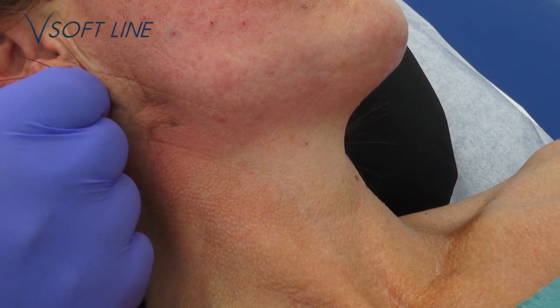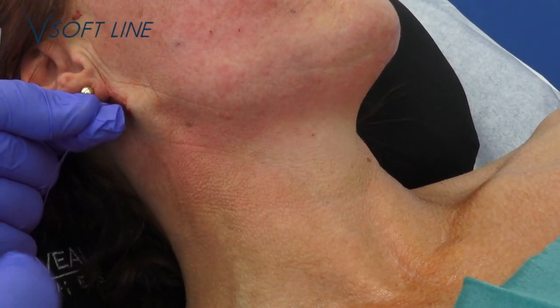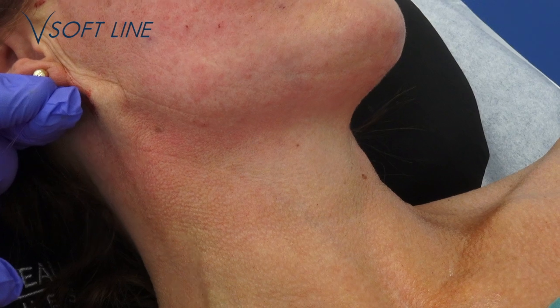Lifting here. Oh, what a lift. Yes, wow. Now we're done with the barbed threads here. Now you can clearly see the difference before and after. You want to make this triangle visible.